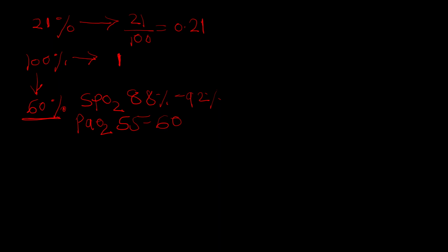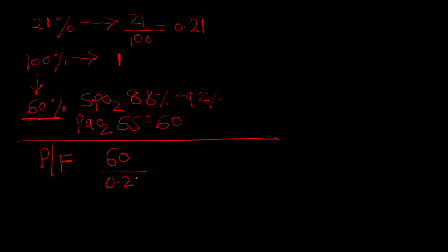That is the first important point in understanding the fraction of inspired oxygen. It also helps in calculating, which we discussed in the ABG session earlier in our critical care training session, the P by F ratio, that's PaO2 by FiO2 ratio. So normally, a patient with PaO2 of 60 millimeter of mercury on room air, that is fraction of inspired oxygen of 0.20 for calculation purposes, or you can take 0.21, you will achieve a PF ratio of 300, which is considered normal.